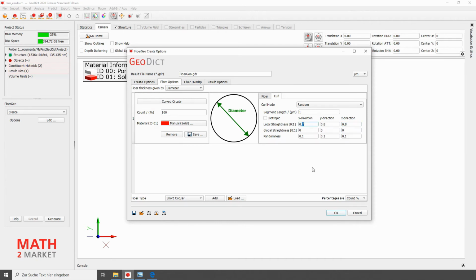For our example, we choose a local straightness of 0.7 in the x direction, 0.3 in the y direction, and 0.1 in the z direction. For our global straightness, we choose 0.4 in the x direction, 0.15 in the y direction, and 0.85 in the z direction. For randomness, select 0.2, 0.25, and 0.05.